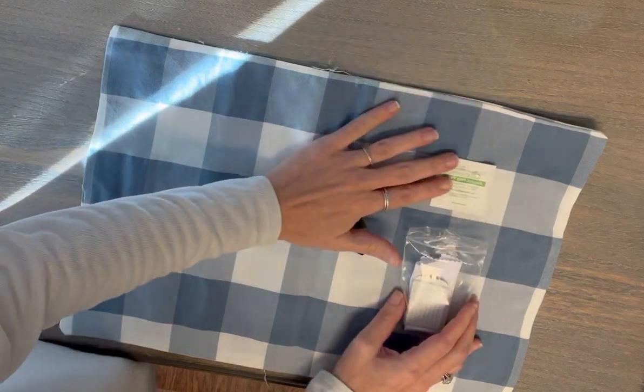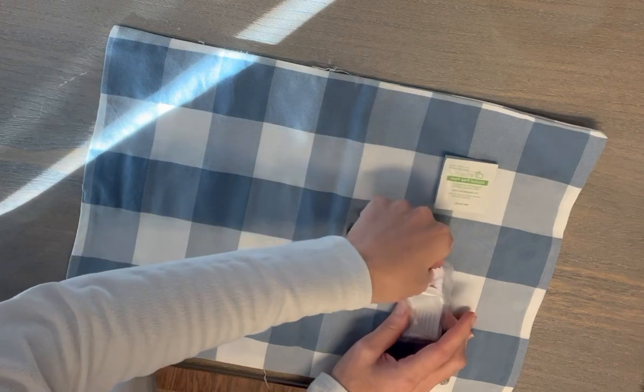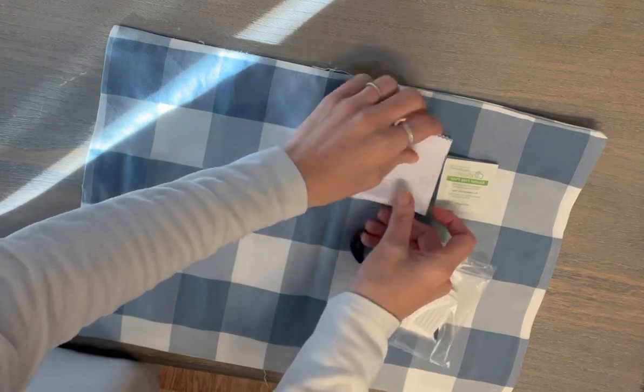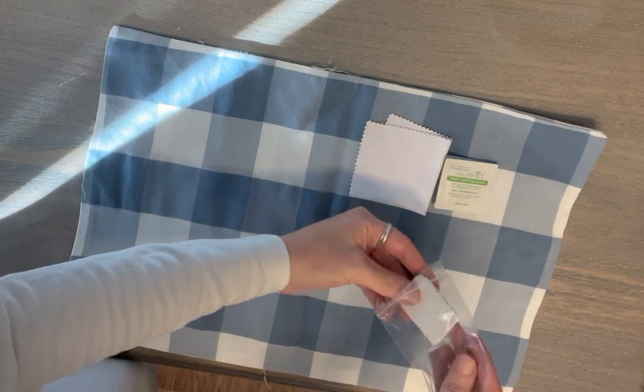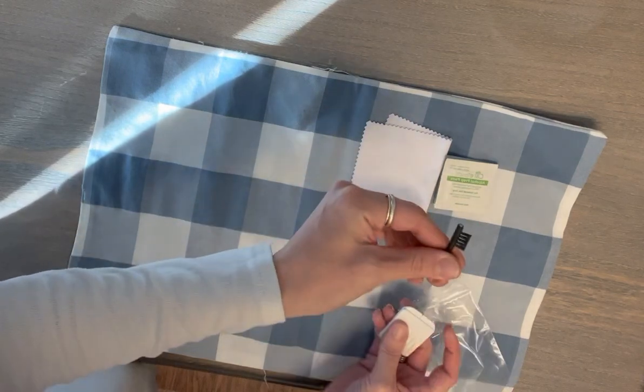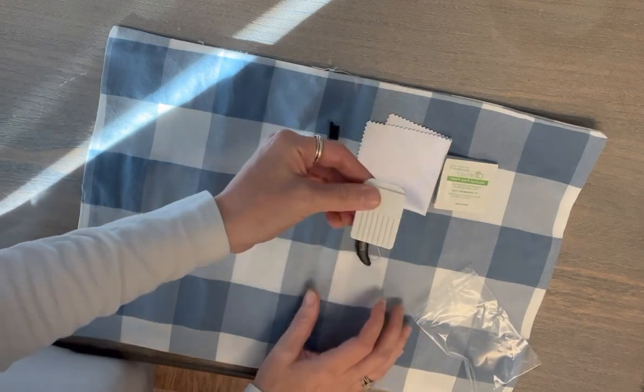First, you have some alcohol pads. You have a microfiber cloth similar to what you use to clean glasses, a brush, and then some filters you may or may not use.